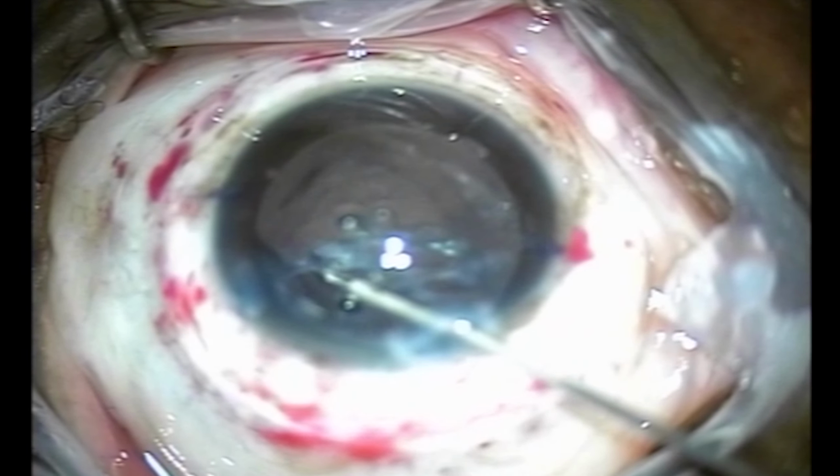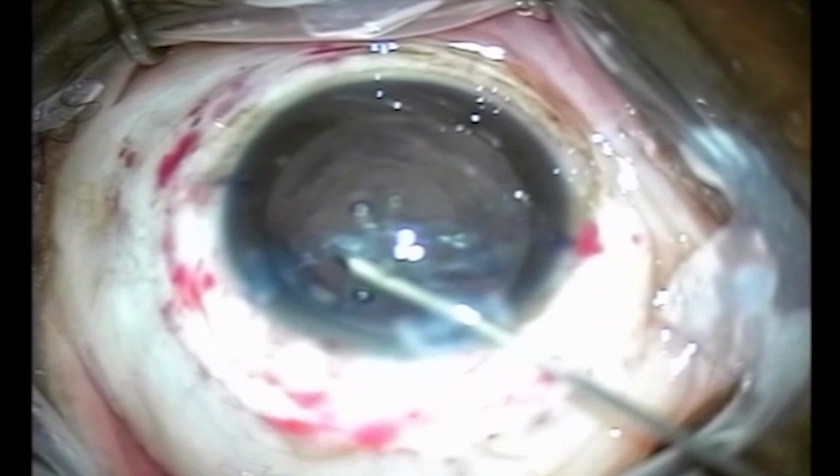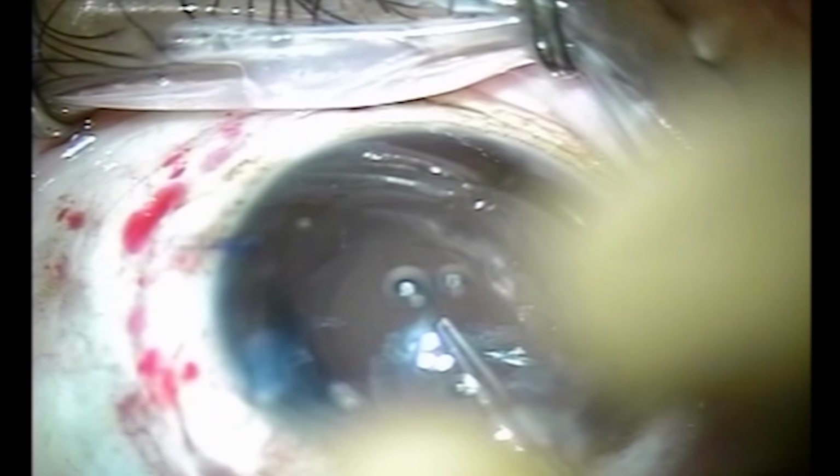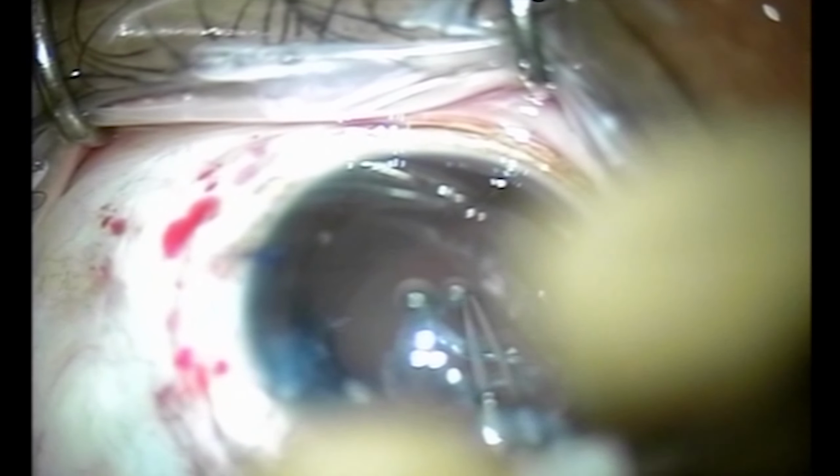Once again, I look for areas of little more approachable capsule, and I start with the cystitome, going in an opposite direction of capsular access from my usual maneuvers, and I'm gratified to see a nice circular access coming about. Once again, I feel the fibrosis, and I do not want radialization or damage to the capsule, which may lose my only support and this patient's hope for excellent 20/20 vision.